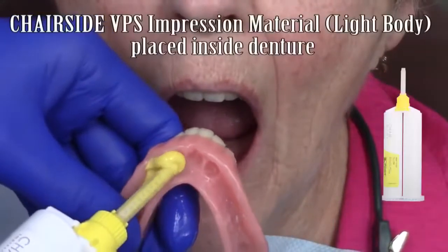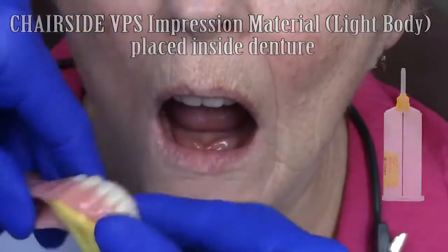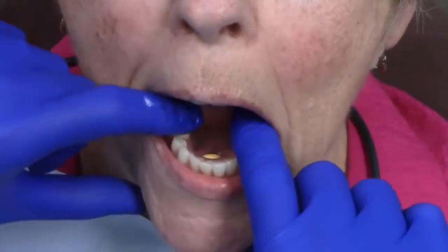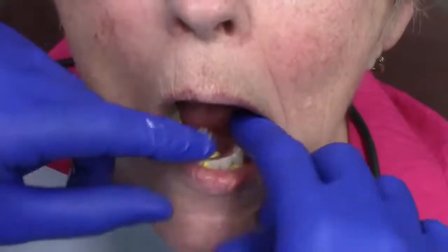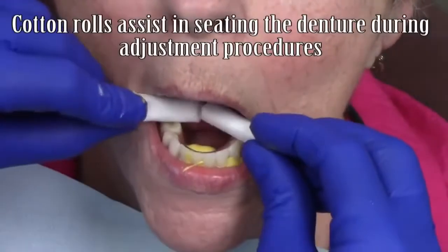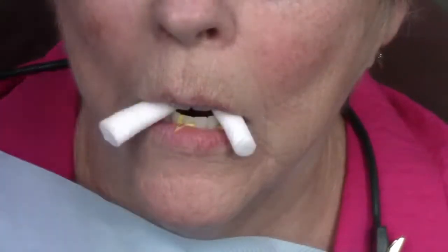Chairside light-bodied PVS impression material is injected into the intaglio surface of the complete denture. Once injected, the denture is seated back onto the edentulous ridge, ensuring complete adaptation of the denture. Sometimes the pressure of the PVS material can be great, so I have the patient biting down on cotton rolls to assist in complete seating of the complete denture.